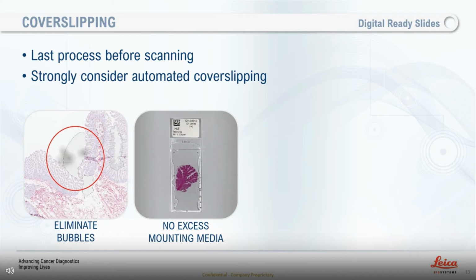Before it's fully cured and hardened and it's in that sticky and tacky state, it runs the risk of sticking to your moving mechanisms within the scanner, whether that's a slide tray or moving on to your scanning stage for that high resolution scanning. Sticky slides are more likely to get stuck in your instrument and lead to a number of problems: jammed slides, broken slides, glass in your scanner.